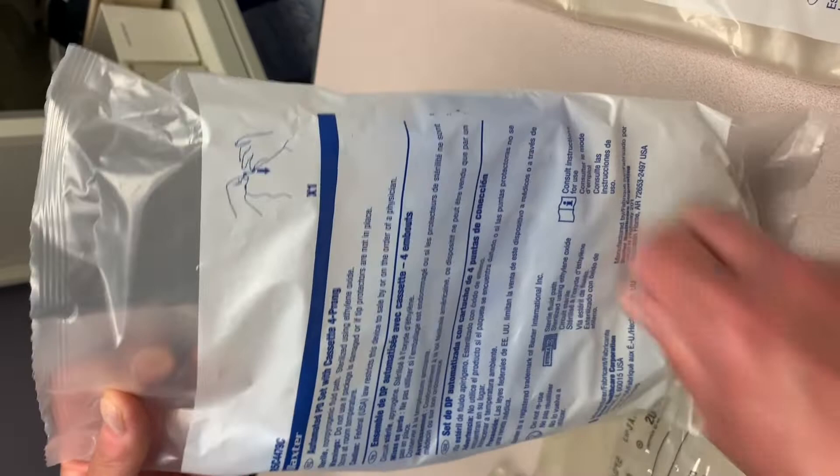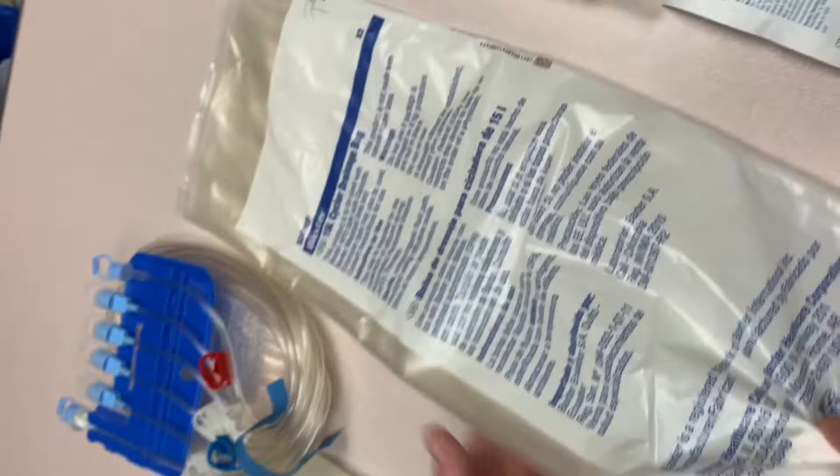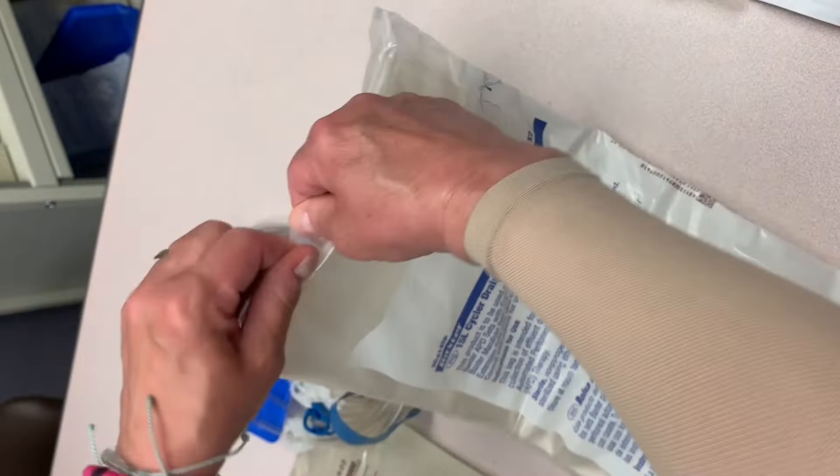You have a Baxter automated PD set with cassettes — four prong. You can go ahead and open those. The drain bags are 15-liter and come two per bag, so you only need one package every two days.